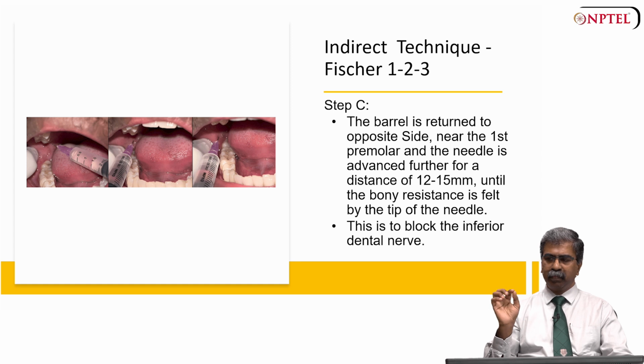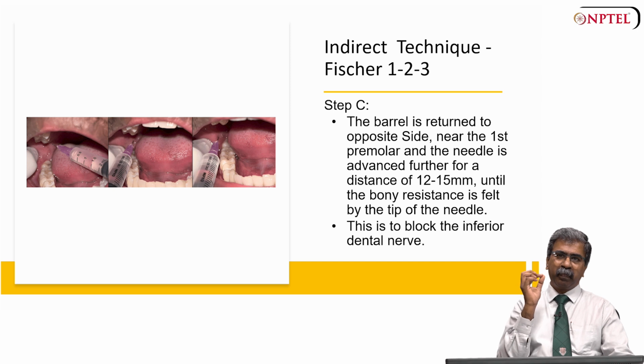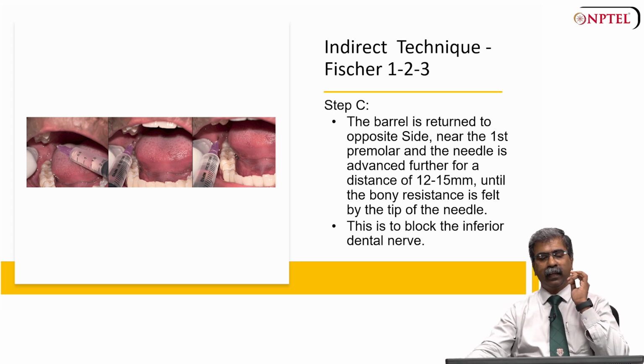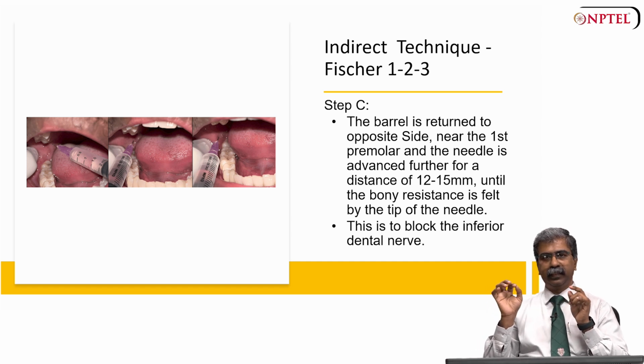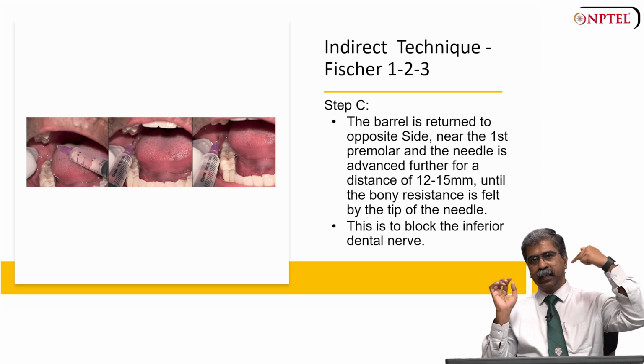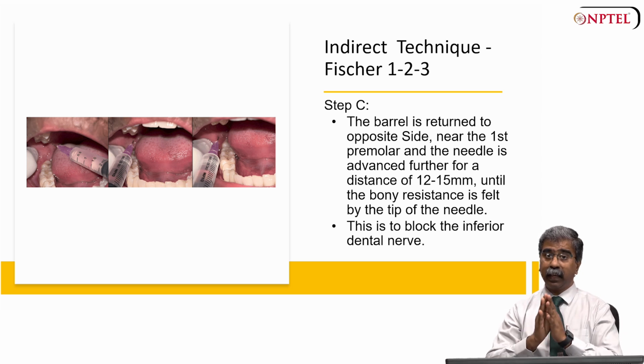For the inferior alveolar nerve, take a sharp instrument, which can be a probe or a periosteal elevator if you are doing an extraction procedure. Try to press it between the 2 premolars, the roots of the 2 premolars. That is where you check for anesthesia for the inferior alveolar nerve, where it exits as the mental nerve. As it enters the mandibular foramen and exits through the mental foramen, it is an intra-bony course. You will not be able to check for anesthesia anywhere else for the inferior alveolar nerve.